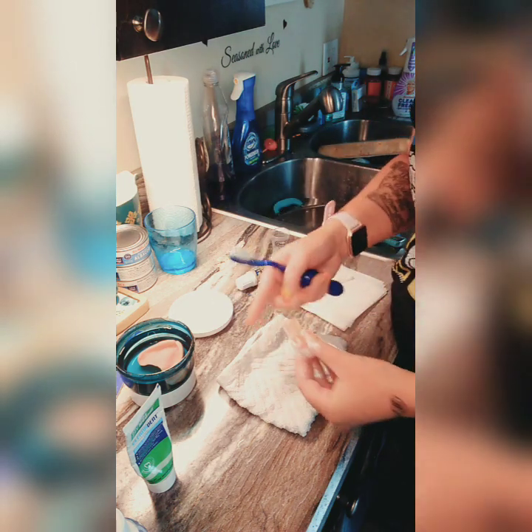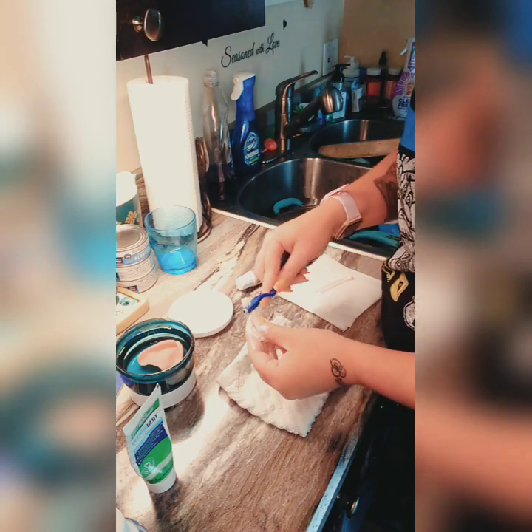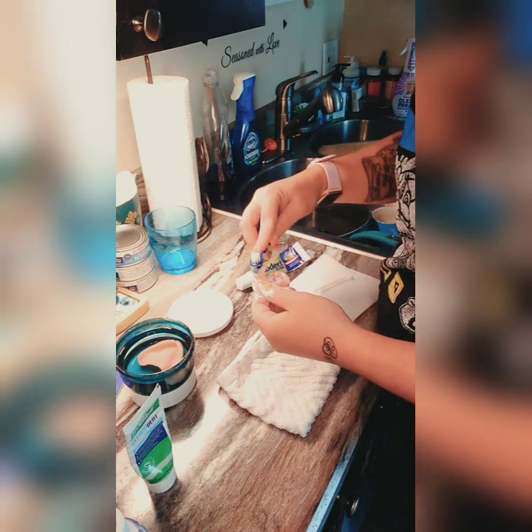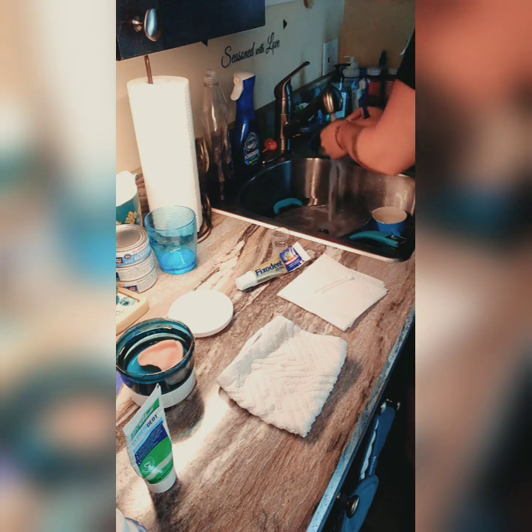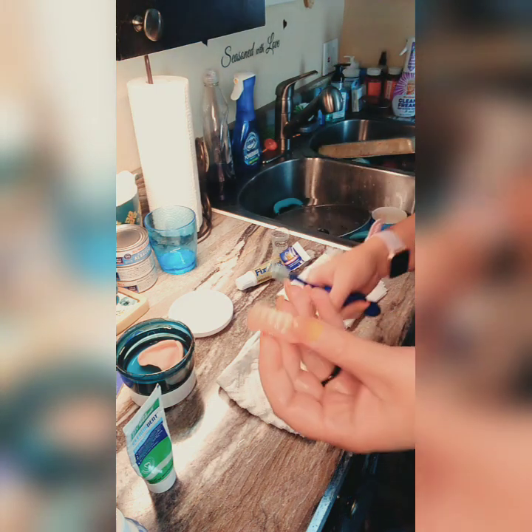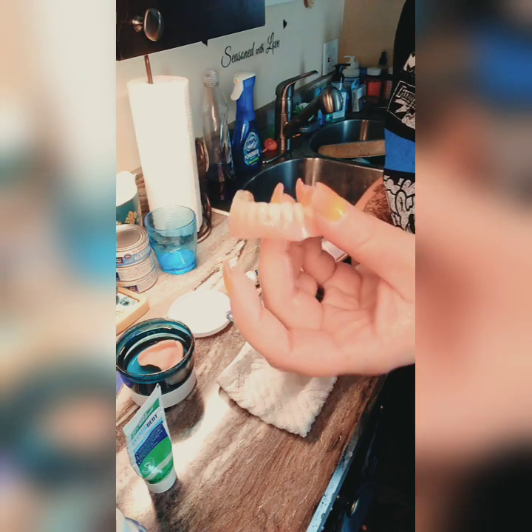I keep a washcloth here to hold the denture. People say fill the sink with water, but why waste water? Plus the denture can break in the sink, so I just use a washcloth. I'm going to rinse this off — this stuff is amazing, it gets it super clean. I only agree with two things for denture cleaning on a budget: Fresh and Bright is great, and Dr. B's Clean It Up paste is my number one.